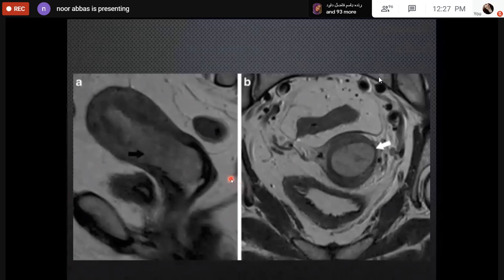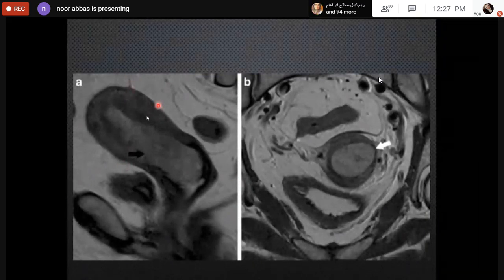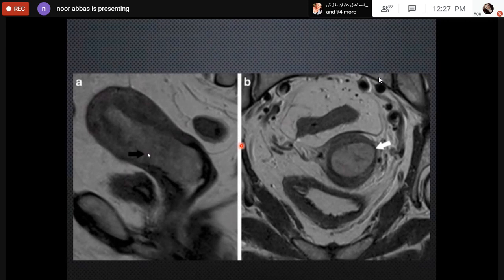إذا تتذكر stage بالنسبة للغينيكولوجي كلش مهم أنه if you're less than 50% of the myometrium, sometimes إذا ممكن يكون حتى perforation and spread to the peritoneum or involvement of the parametrial fat. This is an example of endometrial carcinoma invading into the myometrium, but not spreading beyond into the parametrial fat.